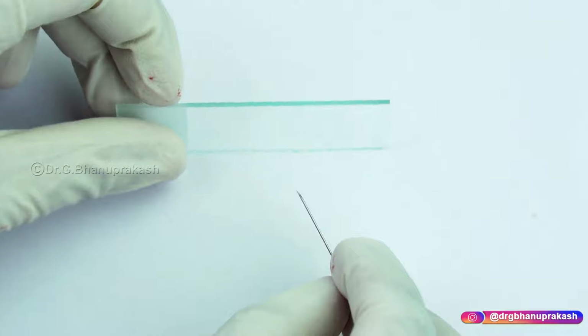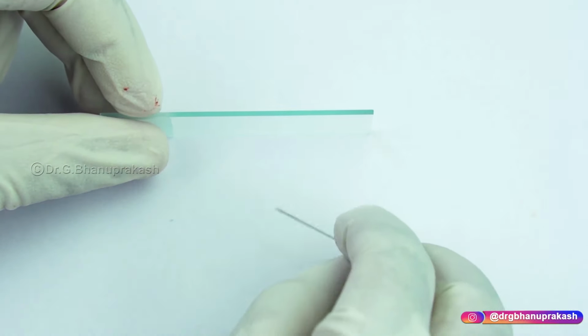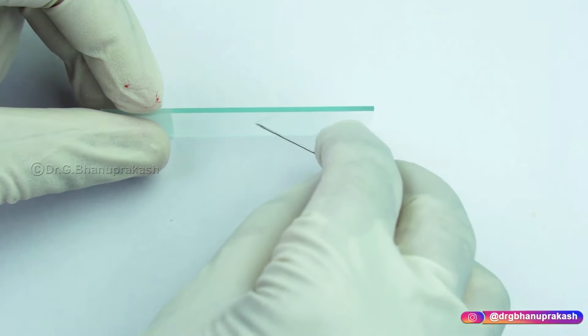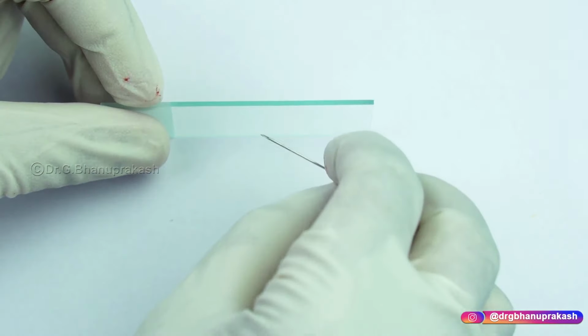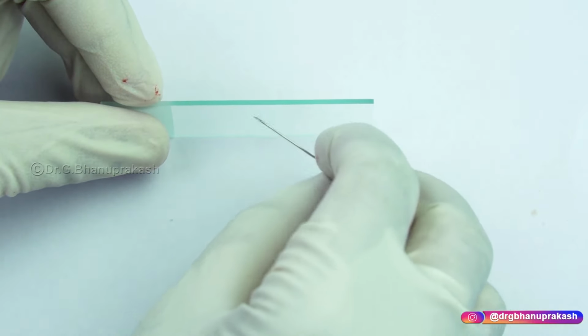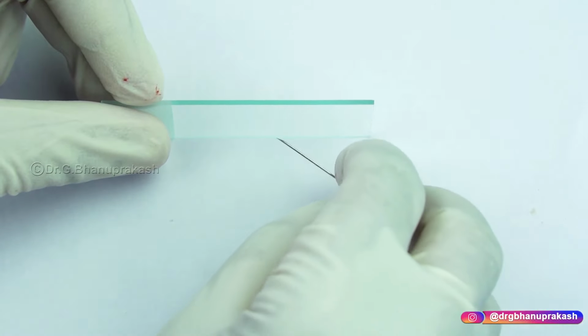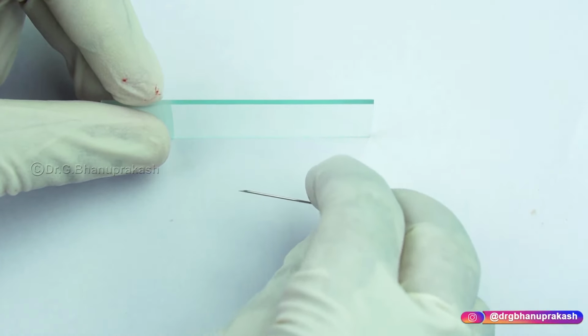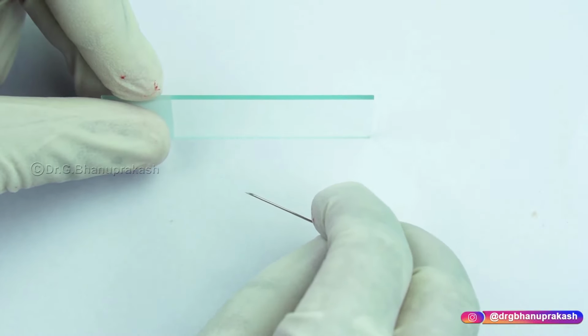So let me show you. For example, you have a drop of blood over here. Now you are running the blood upwards like this. I will be showing it to you in a minute. So when you are running the blood like this upwards, after some time, let us say after 4 minutes or 5 minutes or even after 8 minutes, you will find a small string that is coming out of the blood. That is the time when you have to stop your timer.